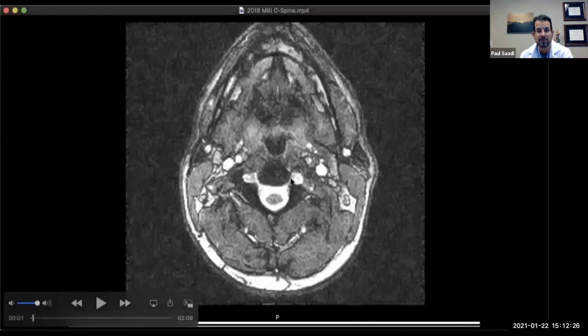I think you probably know where it is. There. Exactly. So that kidney bean right there, if we assume that's 6 millimeters, his tunnel is probably about 13 millimeters, which is within the range of normal. So he's gotten close to losing half of that space.